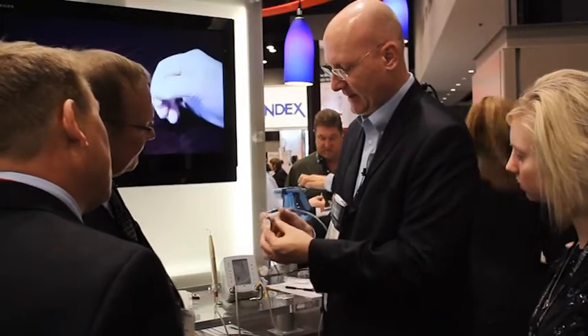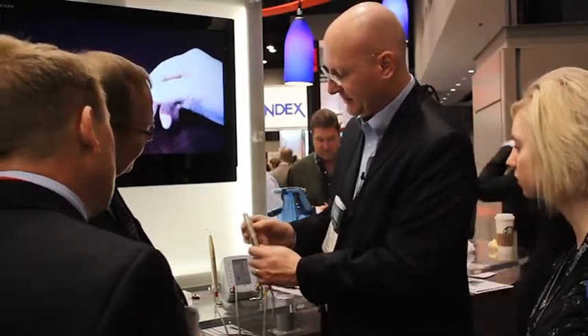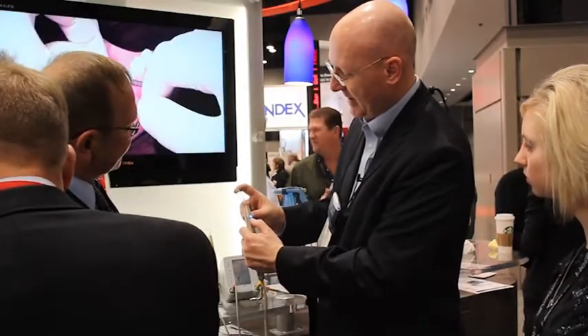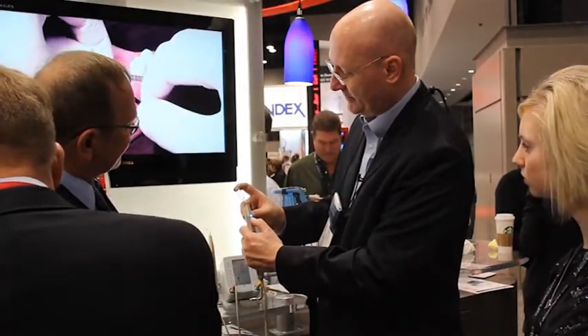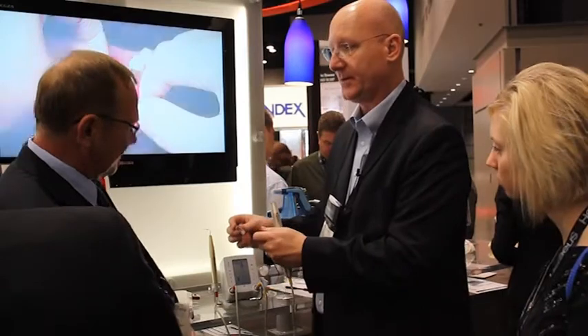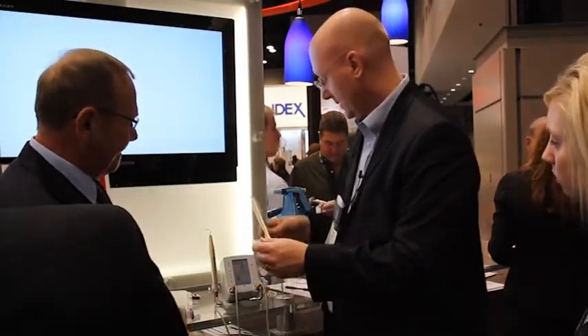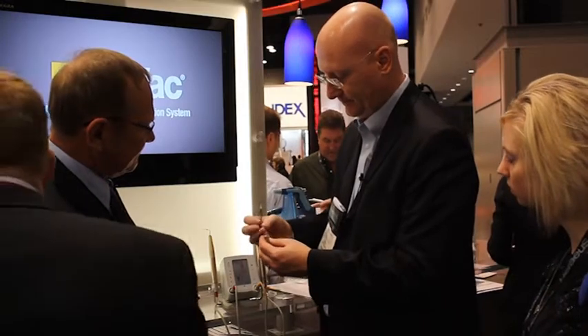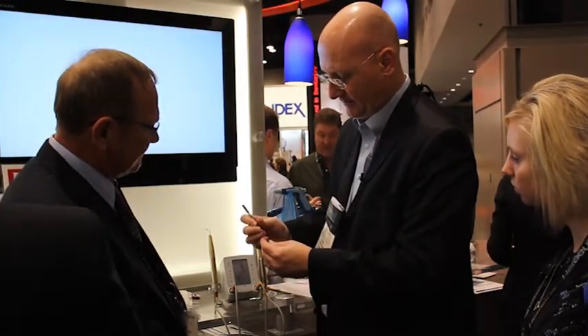For the demo, I like to turn it upside down and put just a little pressure on it. We push the button and it starts backfilling — you can see how the canal is filling. For demonstration purposes I'm using a different color so you can see the backfill compared with the apical plug. Then once you do that, you take your plugger and tamp it down.